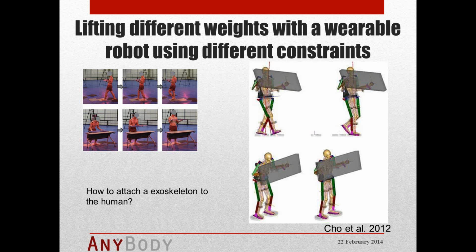And on the left side you see here also recordings with motion capture of a subject carrying some loads in there. And then they have done those simulations in AnyBody, and their conclusion was if you don't carry high loads, the effect of how the exoskeleton is constrained to the human is not very important. However, if there are high loads, it's better if there's a tight connection between human and exoskeleton. So this is just a short overview of what models are out there.